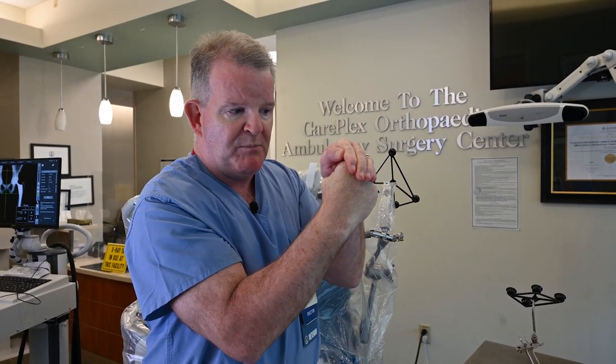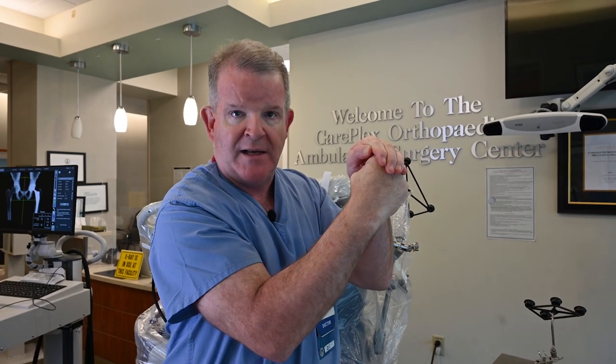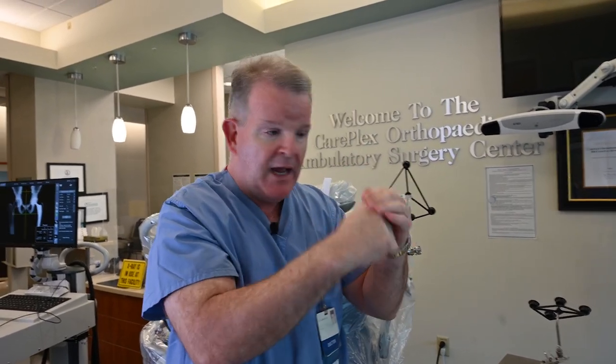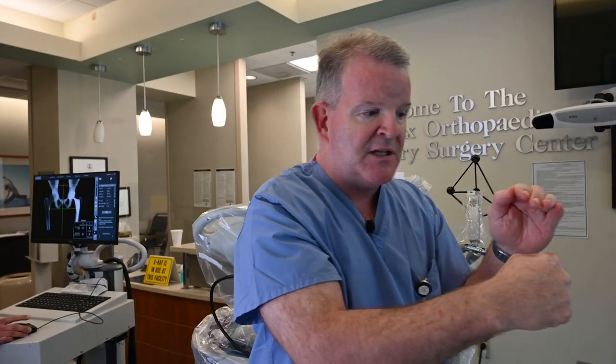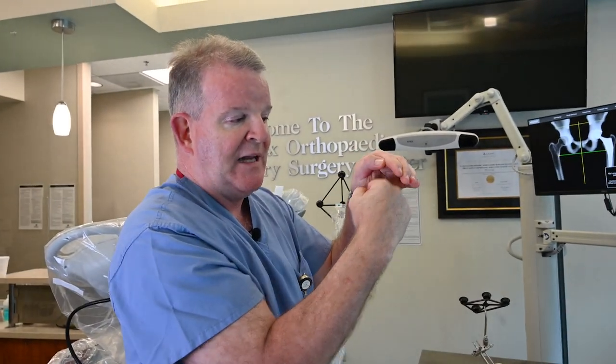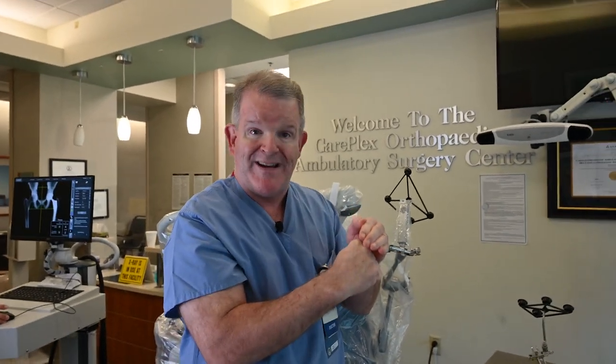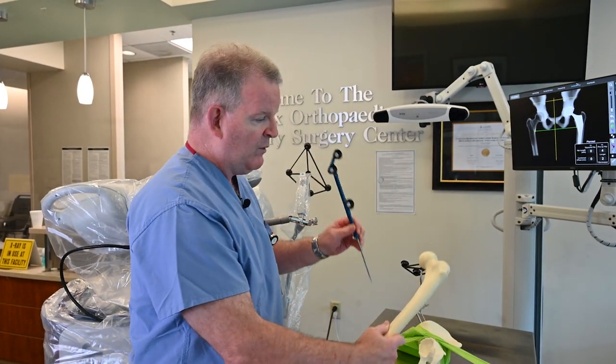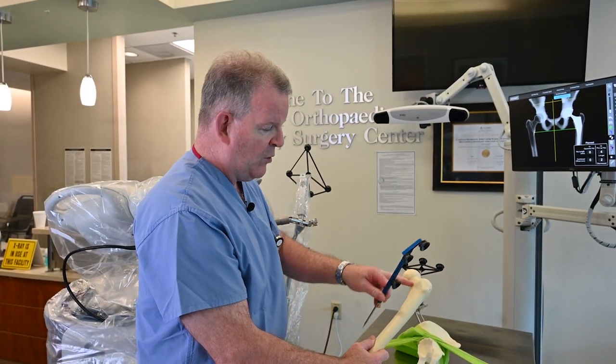So when you do a hip replacement, the goal is not to match that and leave the muscles loose, because that can lead to instability and the hip dislocating and not staying in its place. You want to basically lengthen that hip back to where their original hip center was and get that length back so the muscles are nice and taut and firm, so that you have a nice stable hip throughout a full arc of motion.